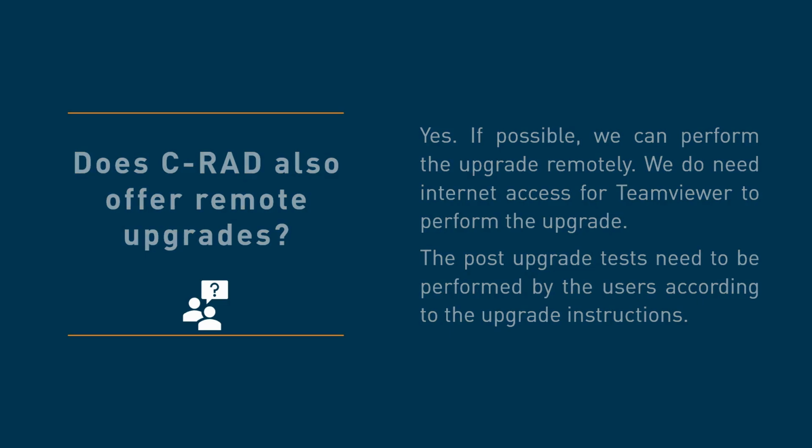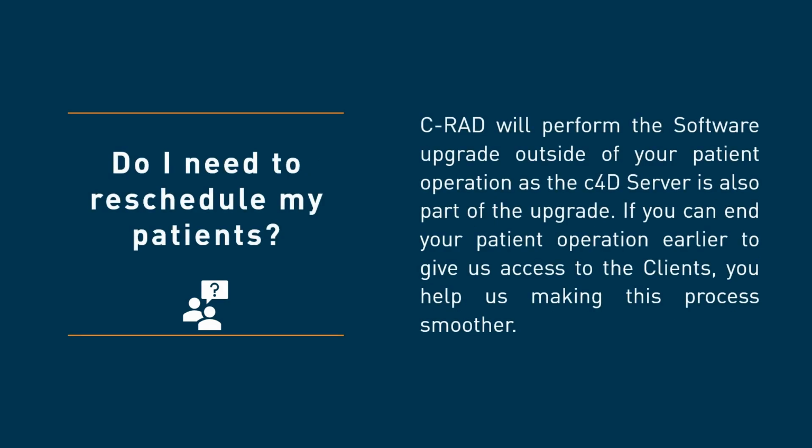There are detailed instructions available for these tests that we are happy to provide. Do I need to reschedule my patients for the upgrade? Well, we need to perform the upgrade outside of your patient operation anyway, since the c4D server also needs to be updated, and this cannot be performed while it is in use by a Catalyst or Sentinel client treating patients. However, the clients can already be upgraded if they are free, but the tests can only be performed after the whole system is up to date. So, if you could end your clinical operation earlier to give us access, you would help us to smoothen the upgrade process.